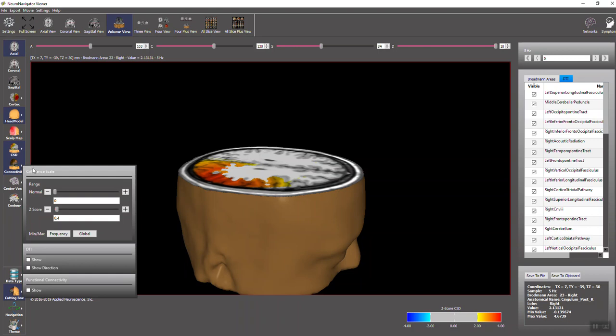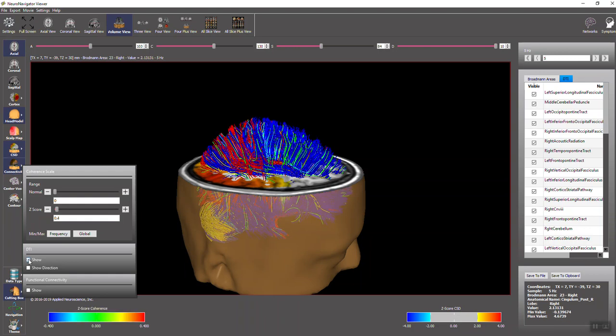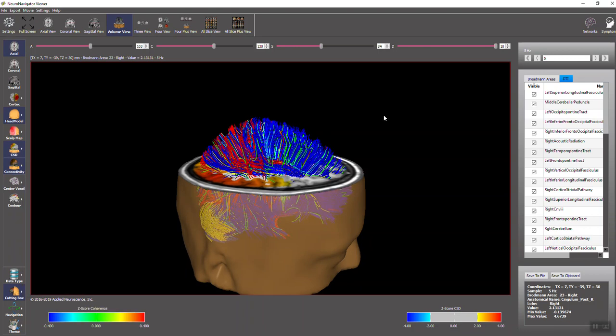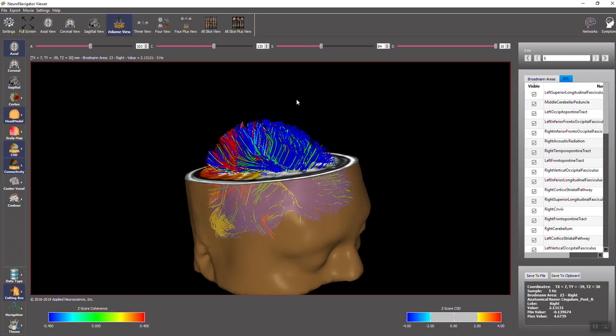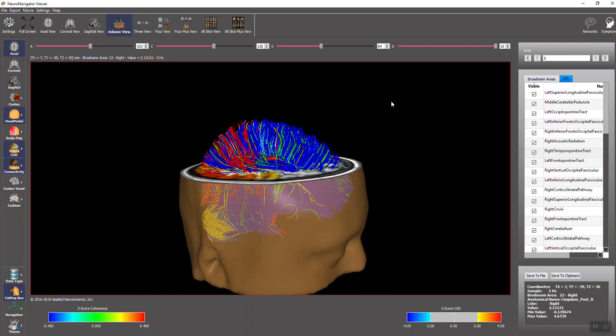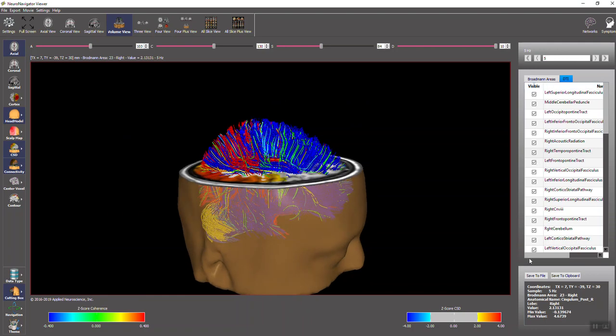You click the coherence scale, right now we've got coherence, and click on DTI show, and there's the DTI. All these bundles over here on the right are now shown.